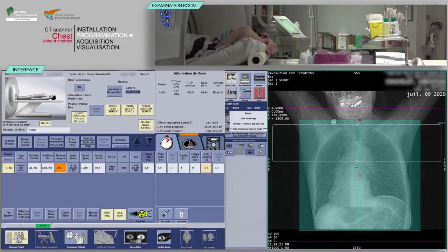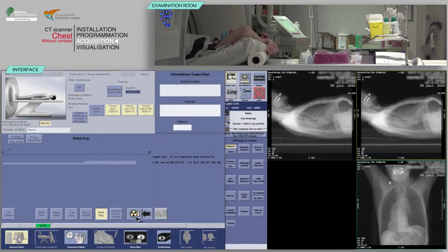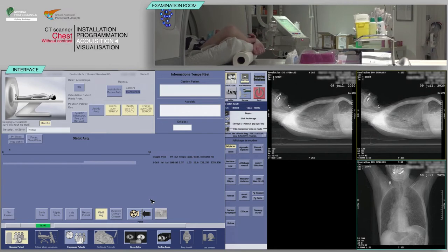Now click confirm. On the keyboard, move the table and begin to scan when the buttons flash.